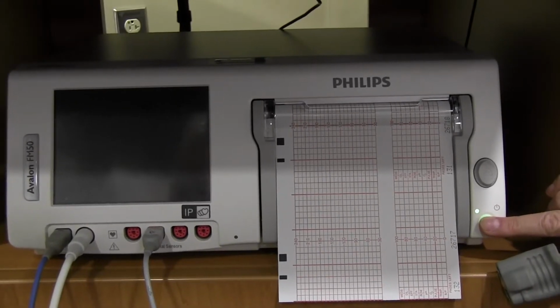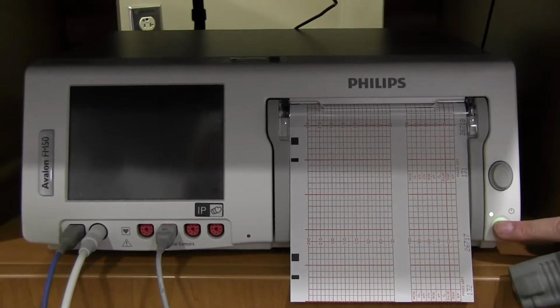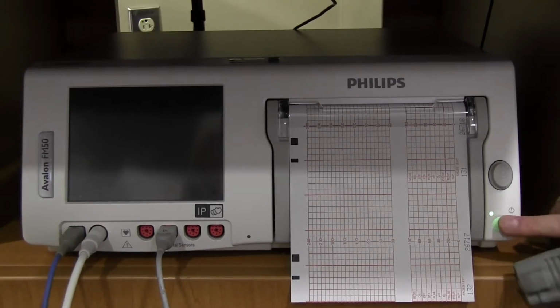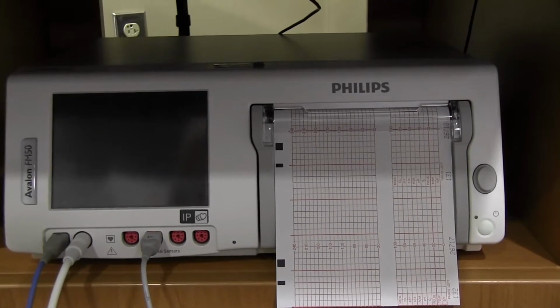Welcome to Navigation Tips for the Philips Avalon Fetal Monitor 50. Press the power switch to turn on the monitor. The monitor will then perform a self-test.